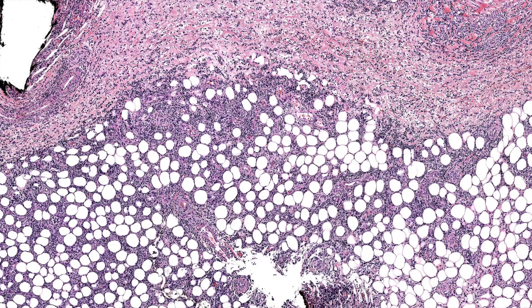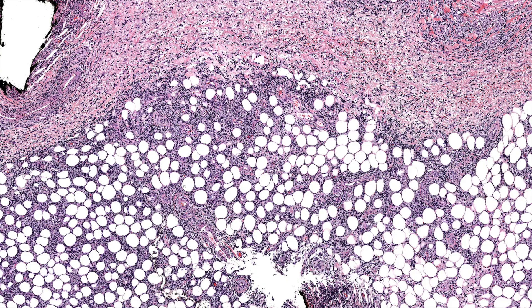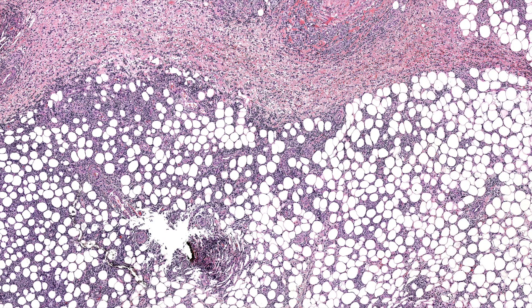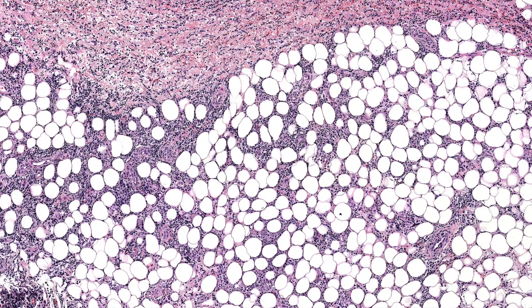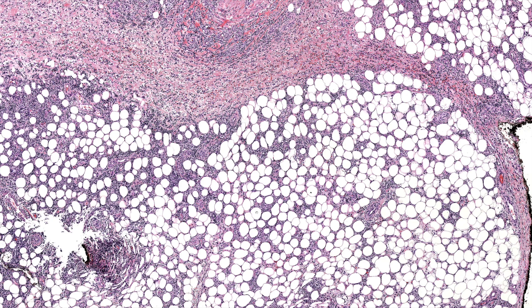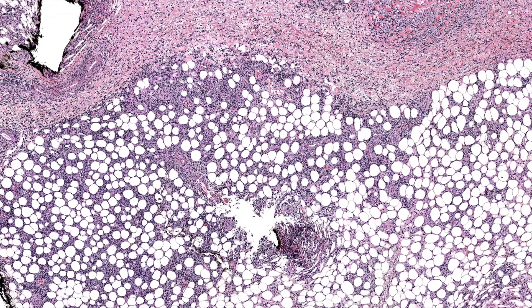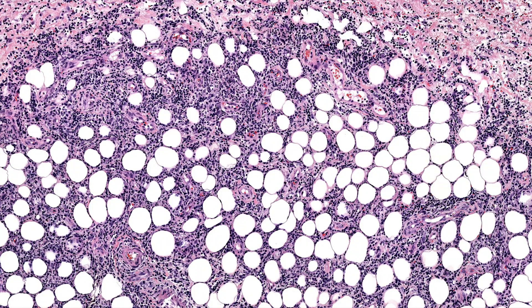And it is an important pattern to recognize, like we talked about earlier in the video, because this is a pattern that can overlap pretty closely sometimes with lupus profundus or lupus paniculitis. And in some patients that have subcutaneous paniculitic alpha-beta T-cell lymphoma, they actually have actual lupus and also have the lymphoma. So it becomes a little bit of a complicated problem sometimes to sort this out. But the classic findings — you have a dense lymphocyte infiltrate, and ideally you like to see atypical lymphocytes.